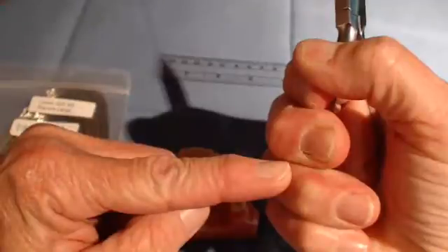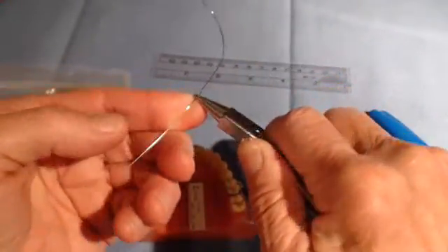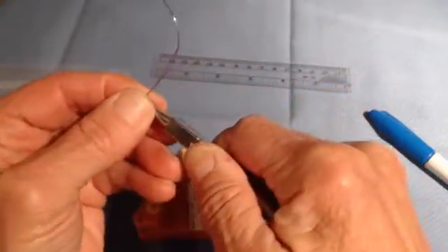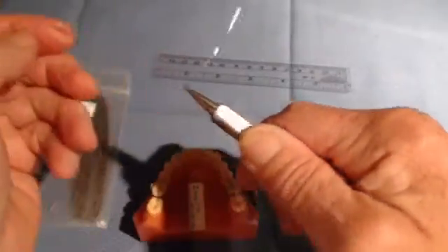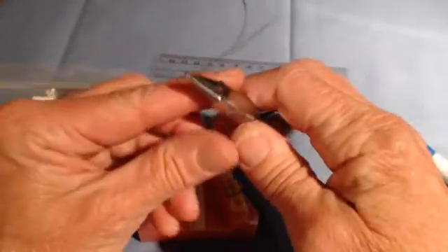You can see that I'm holding tightly. Then roll the wire up over the top of that round beak 180 degrees until you have paralleled those two wires.